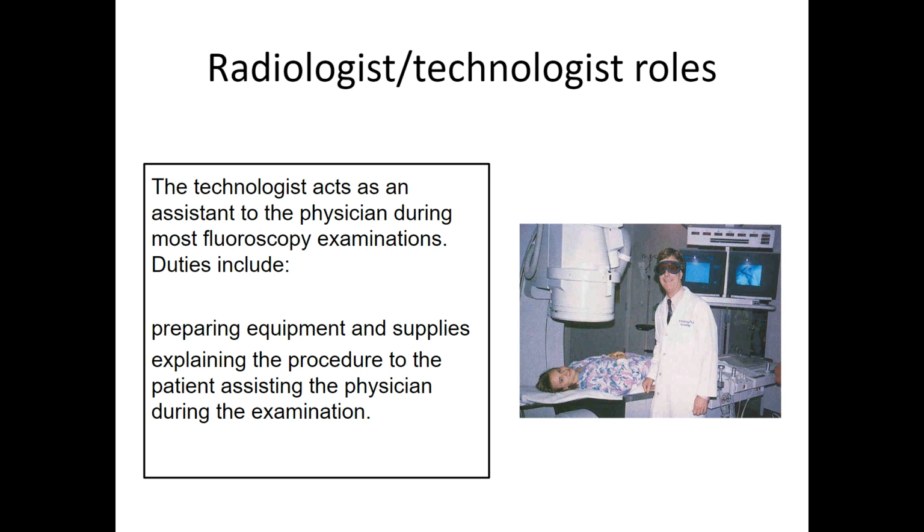In the past, we had to be in the room. We had to wear our aprons. We stood behind the radiologist, and maybe I'm dating myself a little bit, and there were a lot of fluoro cases. You were in fluoro for a few hours every morning, and usually it died down by late morning or early afternoon. The idea for a lot of these procedures, though, is that patients couldn't eat. So you weren't doing much fluoro at 4 o'clock in the afternoon because that would make patients starve themselves. So these things were generally done earlier in the morning, and they just kind of skip breakfast.